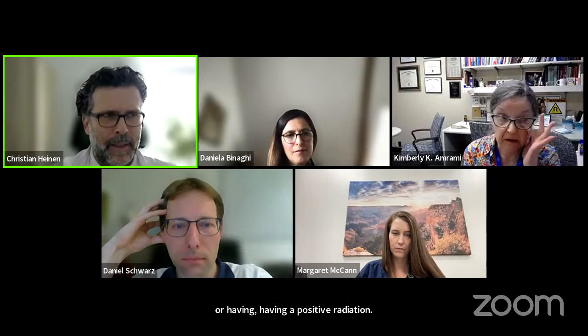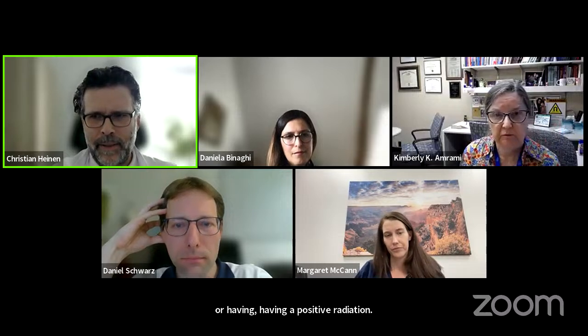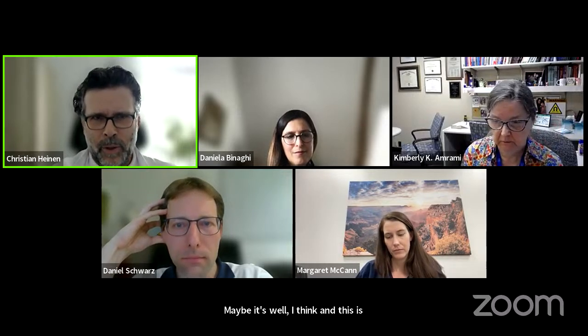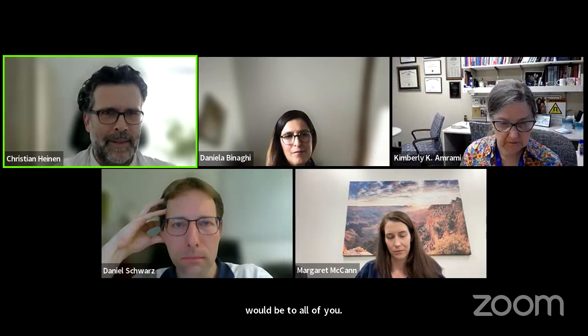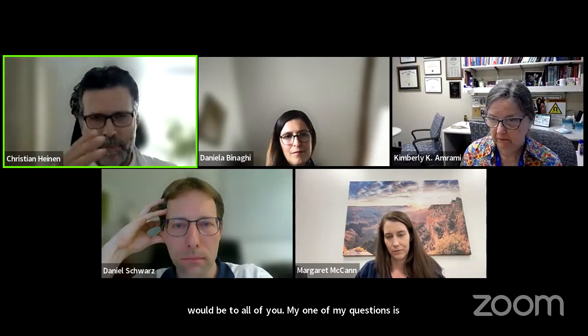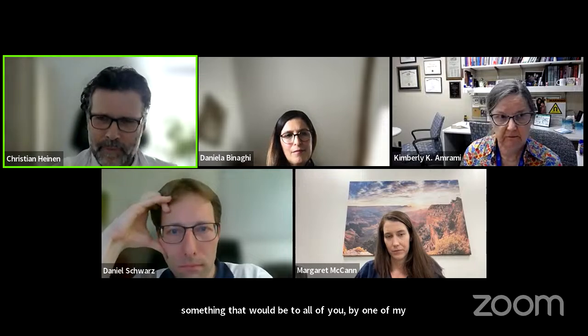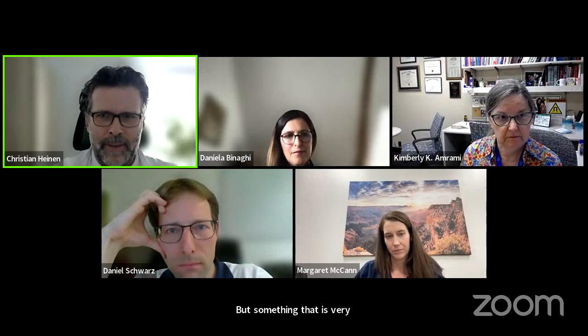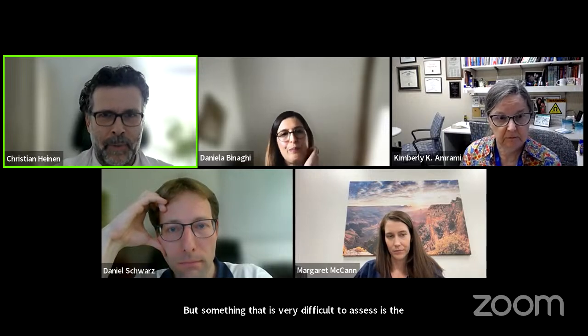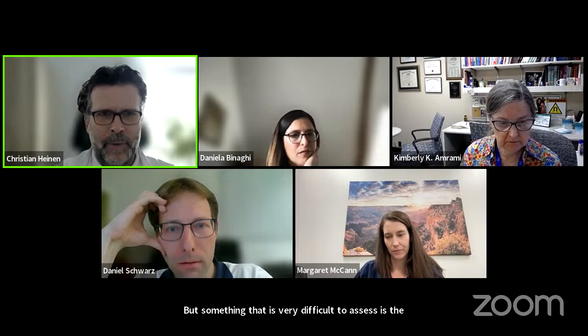Maybe one of my questions to all of you is to look out for the future. We will have talks on that, but something that is very difficult to assess is the nerve vasculature. My interest would be to see how nerve vessels are.